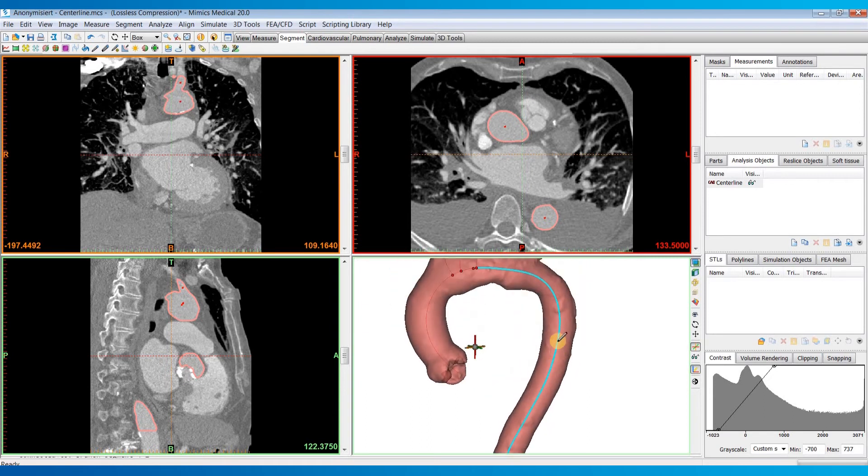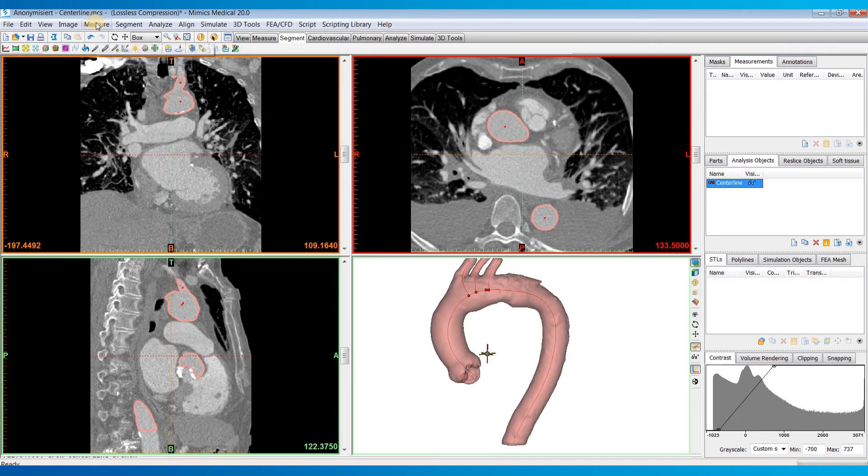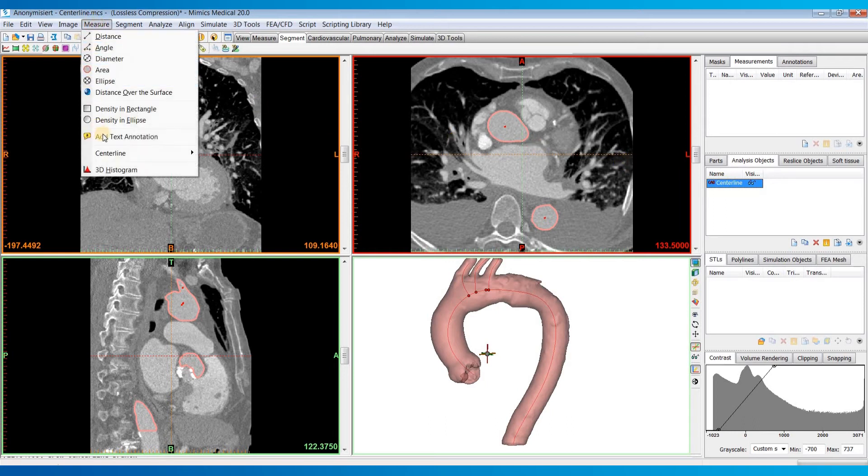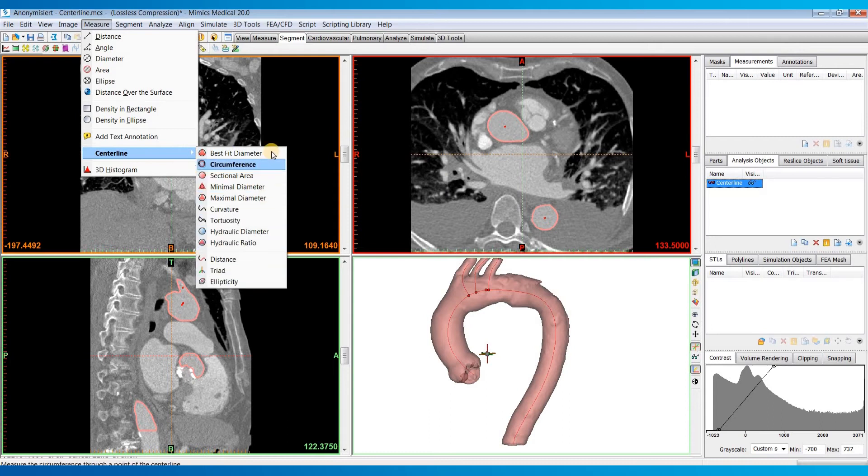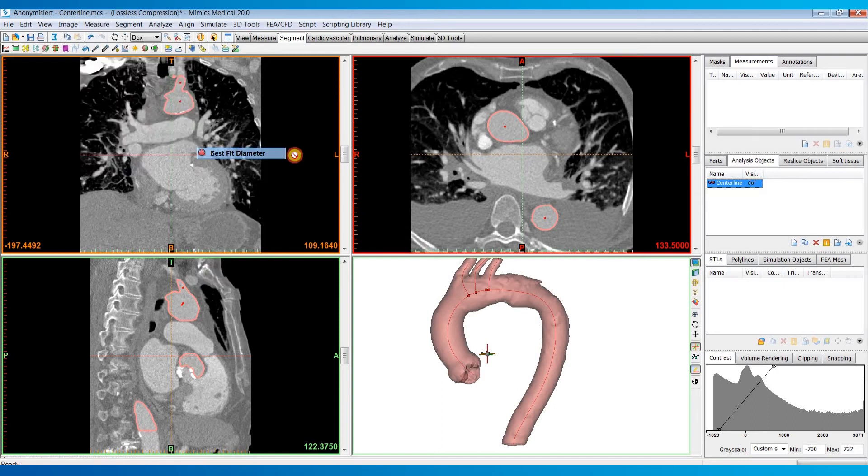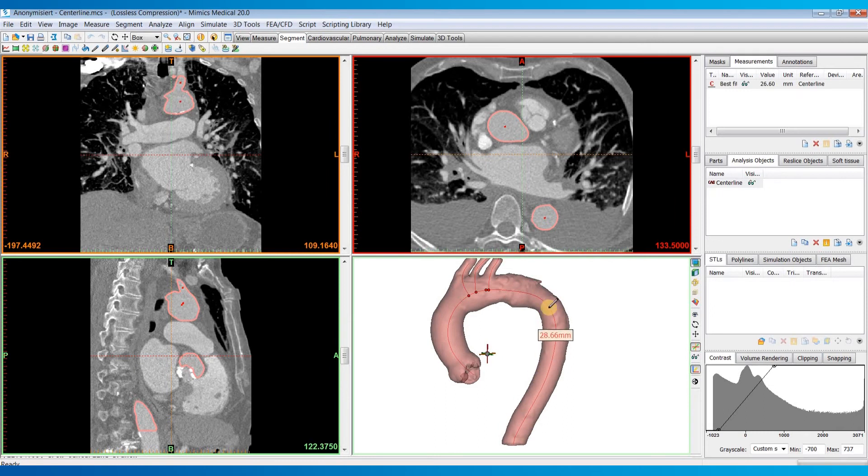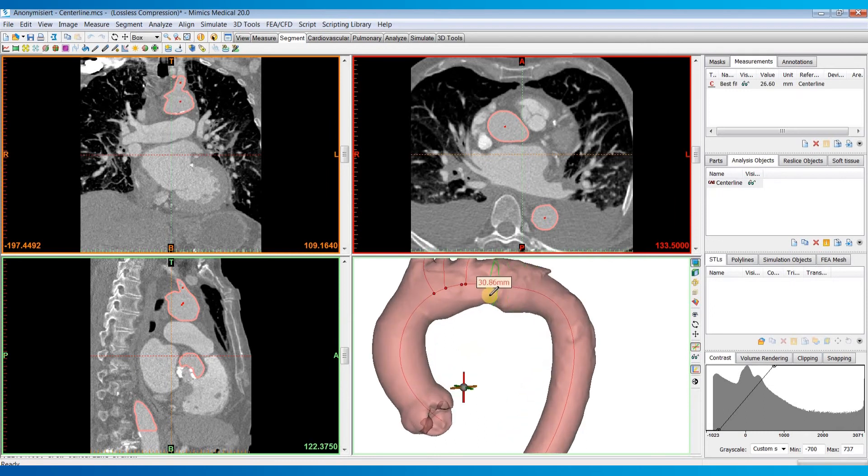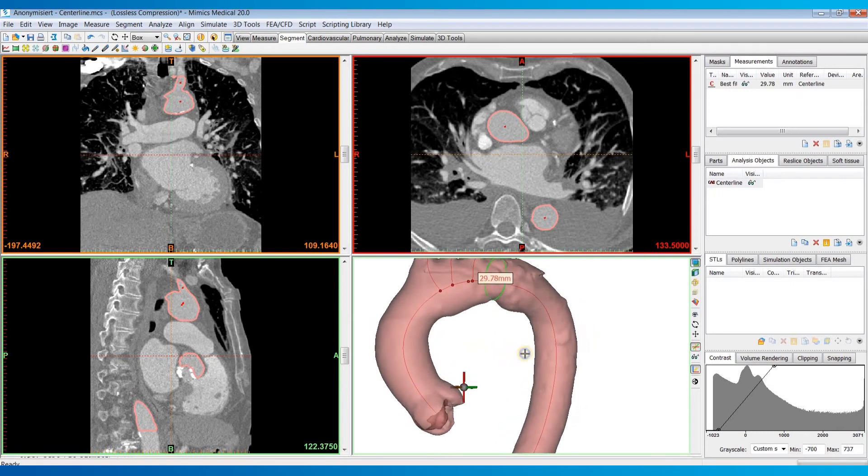Again, all just manual advanced tools for further refining your centerline. Now if we want to do a measurement along the centerline, we'll go to the measure menu. Hover over centerline and you'll see all the different measurements that you can make. So let's maybe just choose best fit diameter for an example. And then you can basically take your mouse and click on any point throughout that centerline that you would want to make that measurement.